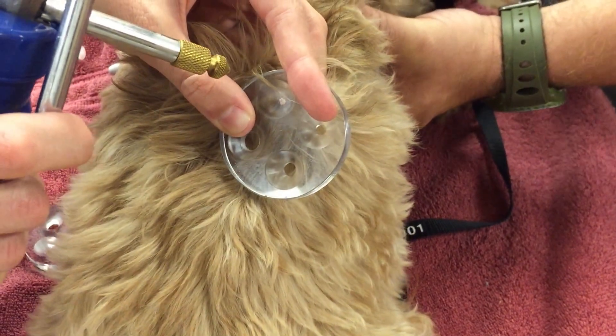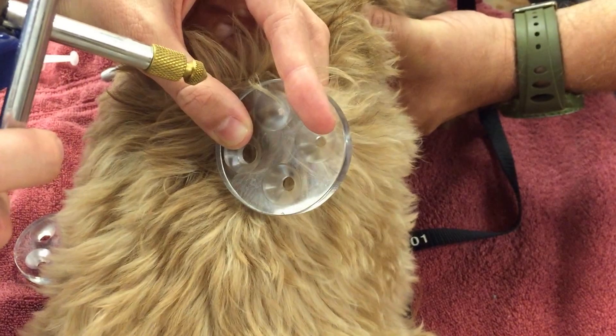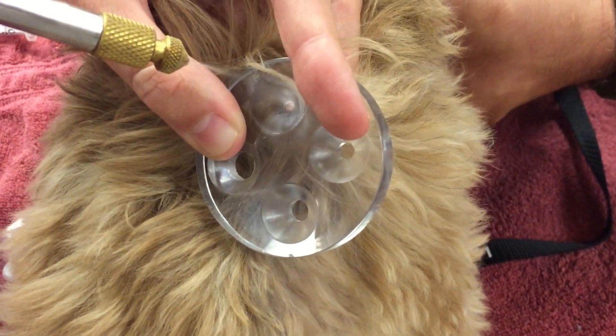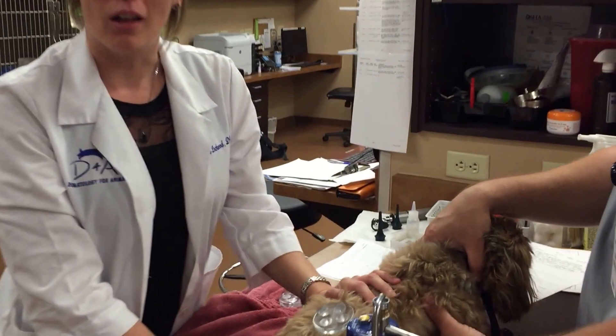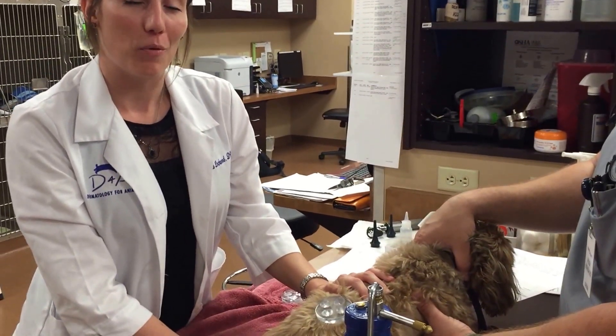We feel the backside to see if it's cold enough. Once it sticks, we let it sit, and eventually the plate will fall off and the mass will fall off a couple of weeks later.